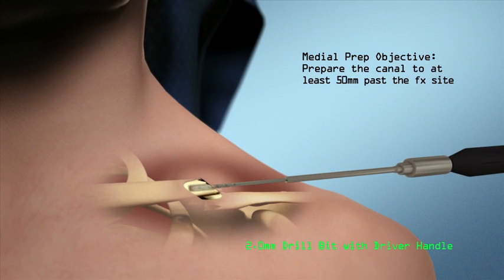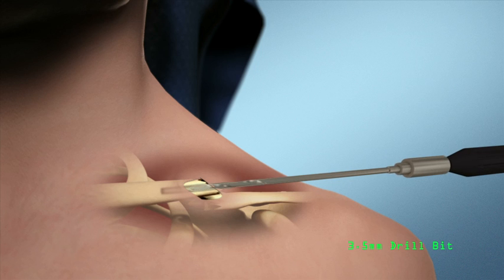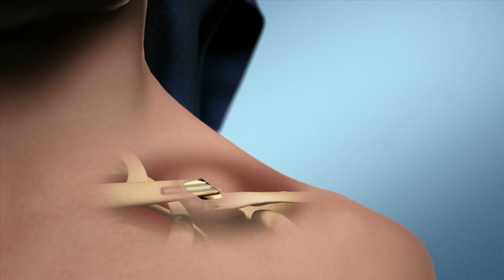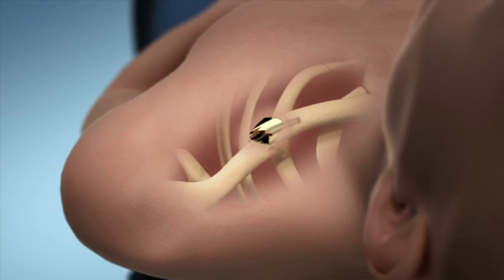Medial prep objective. Prepare canal to at least 50 millimeters past the most medial edge of the fracture. Elevate the medial fragment and sound the canal using 2 millimeter and 3.5 millimeter drills to a minimum depth of 20 millimeters. Use caution to prevent penetrating the anterior cortex with the drills.